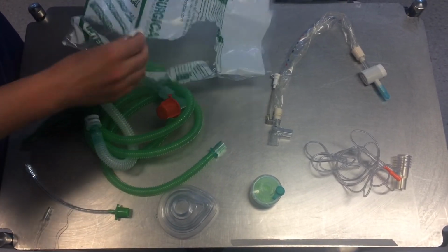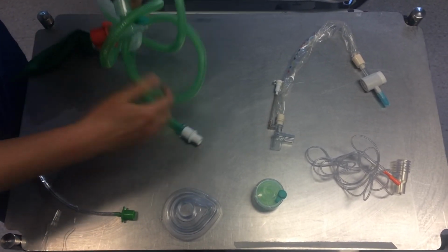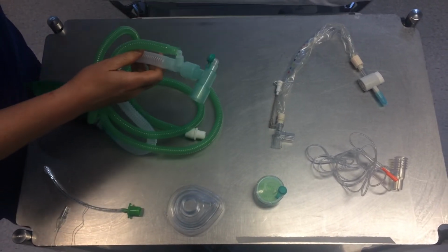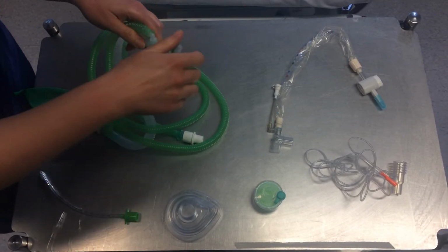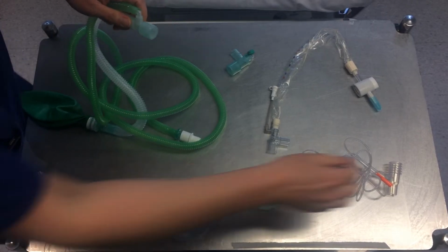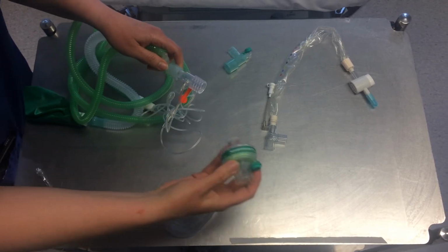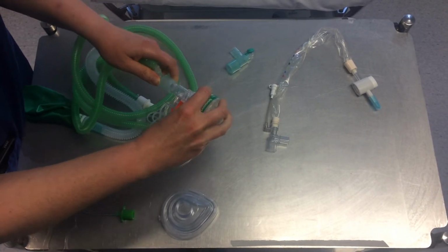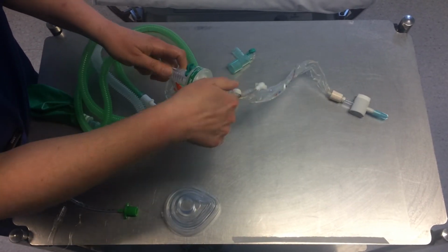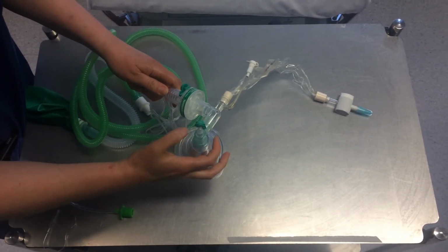And this normally comes in a separate bag and needs to be put on the end. We're going to take the red cap off and that can be discarded. We're going to remove the angle piece for the time being, and we're going to connect first our end-tidal CO2. We then need to put the filter on, the inline suction, the angle piece, and then the mask.